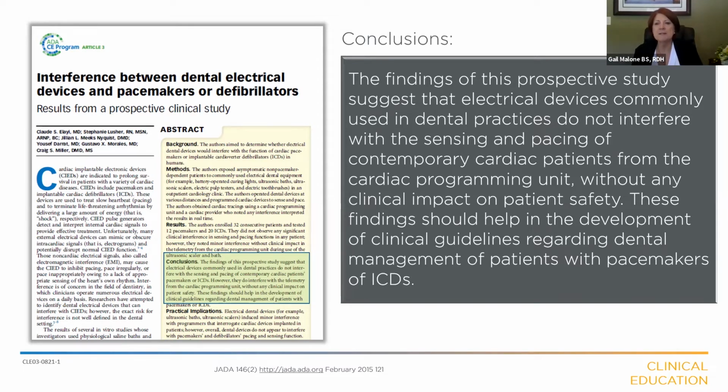The authors state that these findings should help in the development of clinical guidance regarding dental management of patients with pacemakers. And regarding the practical implication, the authors of the study state that overall, dental devices do not appear to interfere with pacemakers and defibrillator pacing and sensing functions.